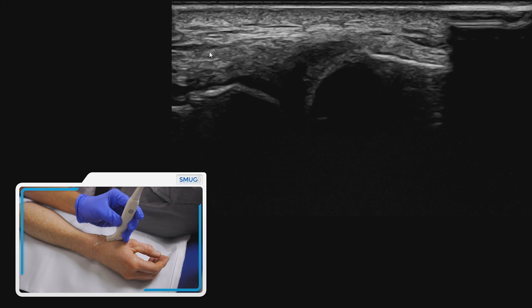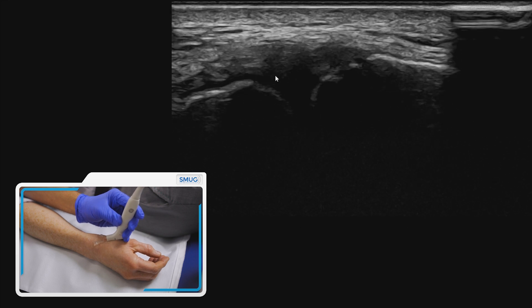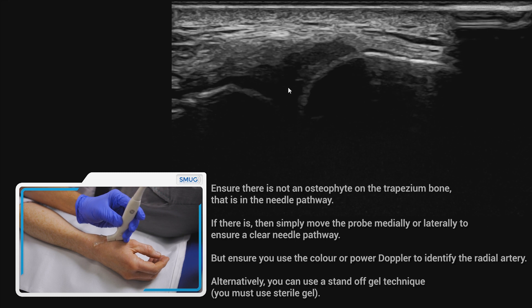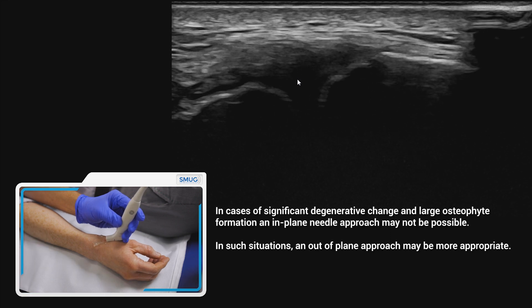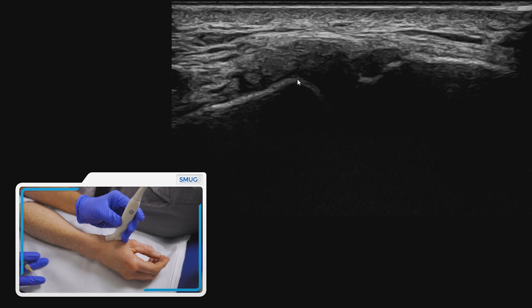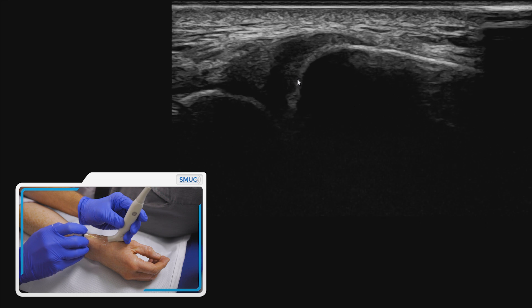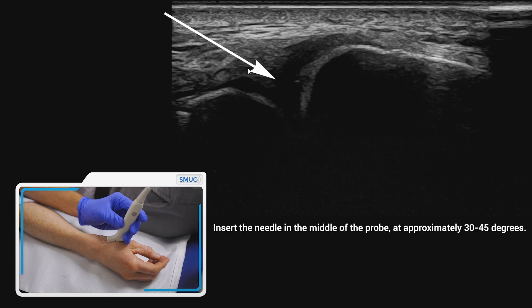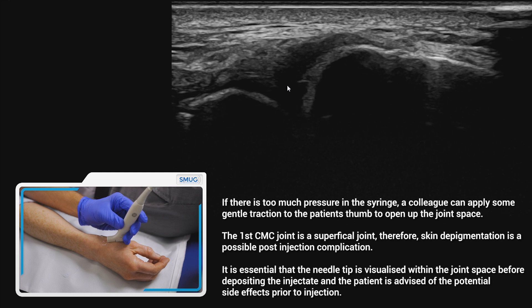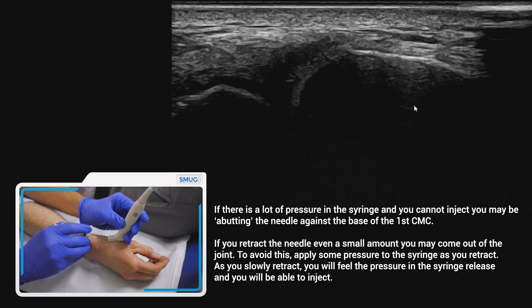We're going to use an orange needle for this and we're going to aim the injection into here. Normally there are some osteophytes which can make it a bit tricky, so sometimes you do need to work around the joint to find a nice opening. We're just going to aim the needle here — often there's a bit of fluid you can aim for. Obviously you're going to use sterile gel if you're actually doing the injection. Then we're just going to aim into the middle of the probe, going in at about 30 degrees, and I want to end up in this region here or just underneath the capsule. So start nice and close to the probe and go in at about 30 degrees.